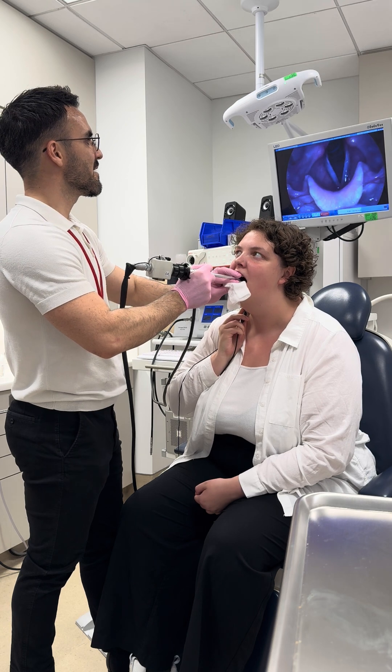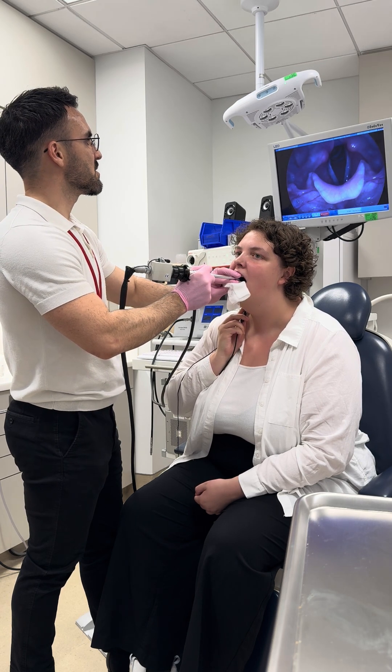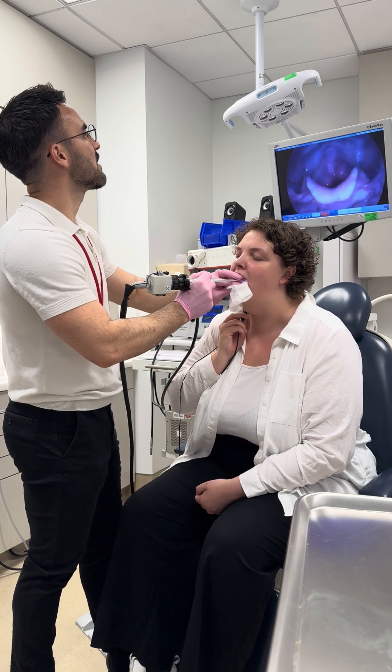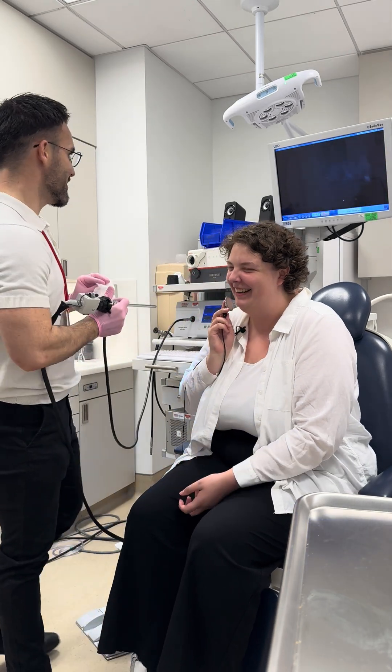Good. Breathe and do it again. Good, keep your tongue nice and soft and do it one more time. Good, go he, he, he, and breathe between each. Ha, ha, ha. And now do he, he, he. Yeah, really good, really good.